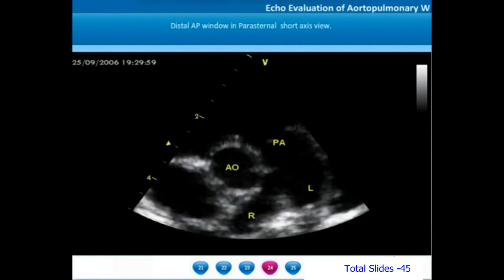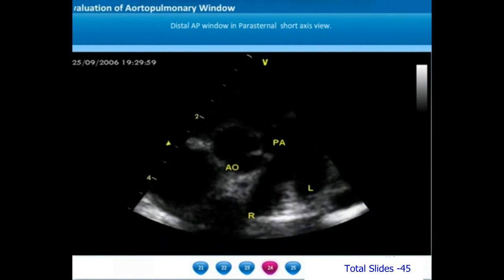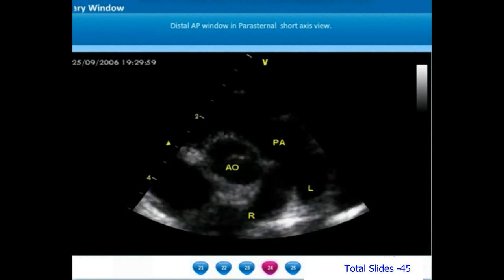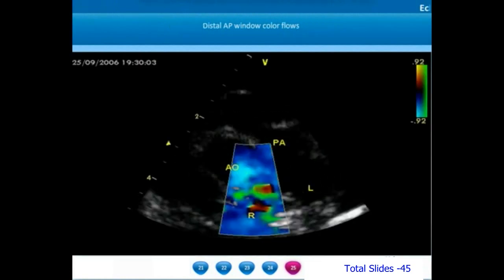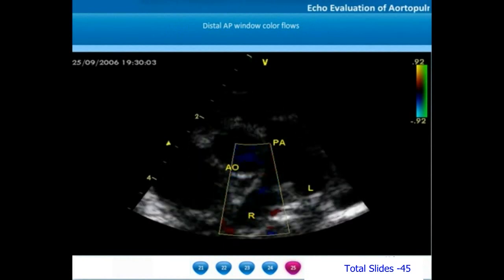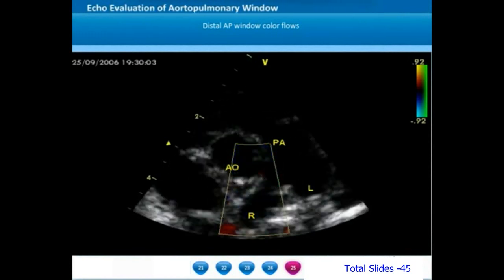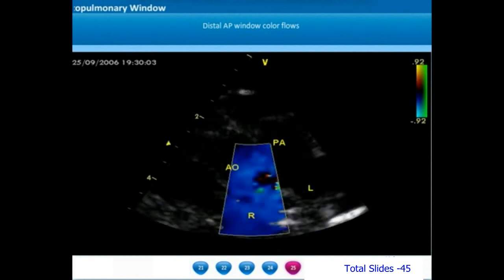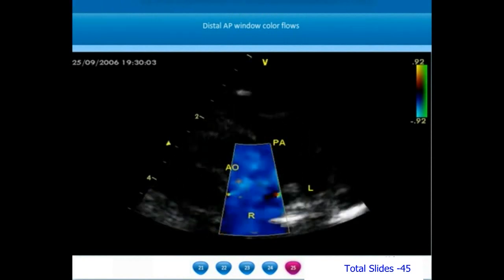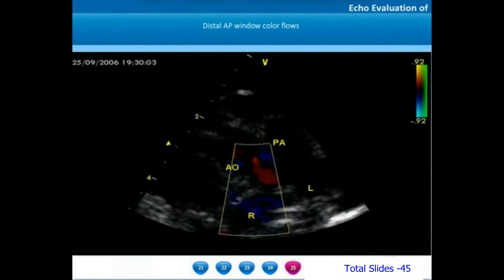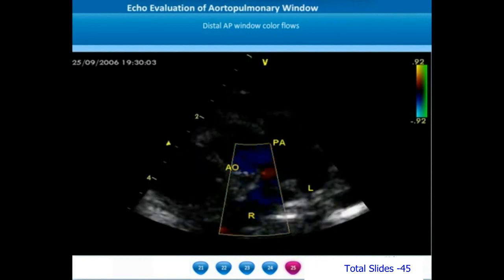On yet another parasternal short axis view of the same distal aortopulmonary window, we notice the aortopulmonary window in close relation to the right pulmonary artery origin. On color flow interrogation of this large distal AP window, we notice color flows across the distal aortopulmonary septum. The color flows do not show significant turbulence because most large aortopulmonary windows are associated with similar pressures between aorta and pulmonary artery, so color flows will often be laminar at low velocity.